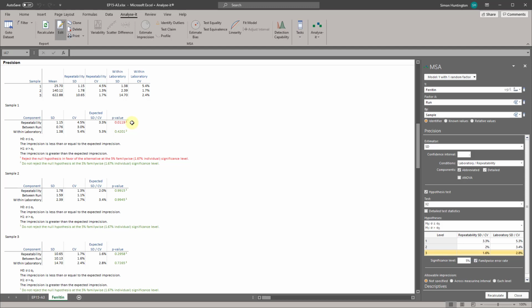You should contact the manufacturer for assistance in diagnosing the problem when you fail to meet their product claims. If the hypothesis test is not statistically significant, but the imprecision estimate is much larger than the claim, you may want to repeat the study with more data to be able to detect smaller departures from the claim.